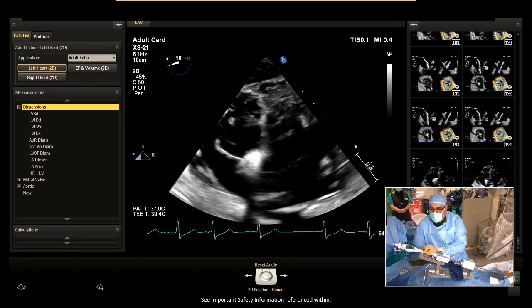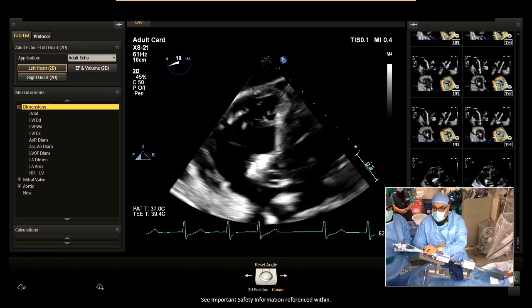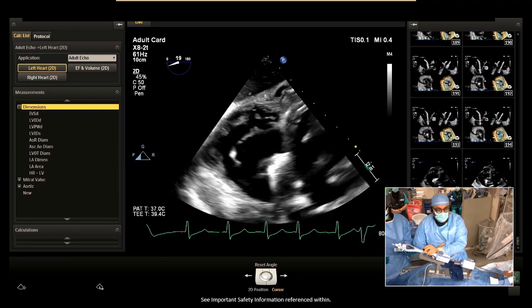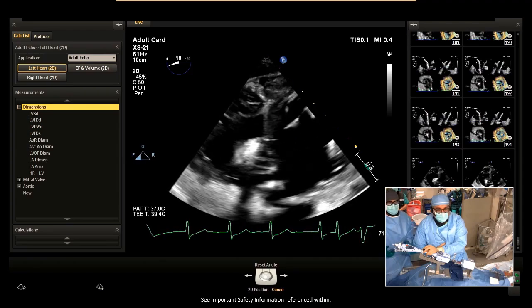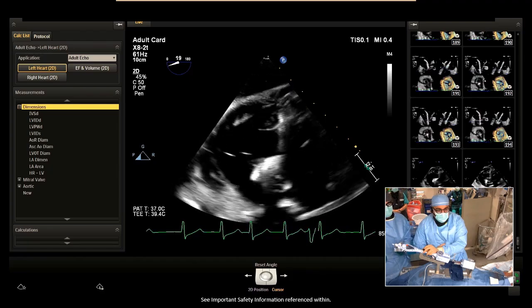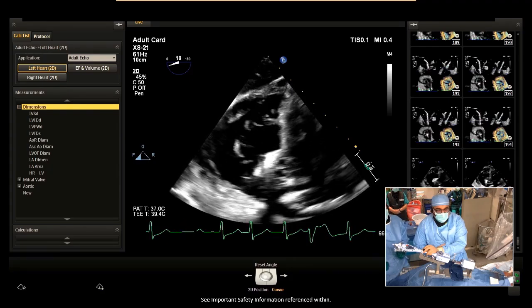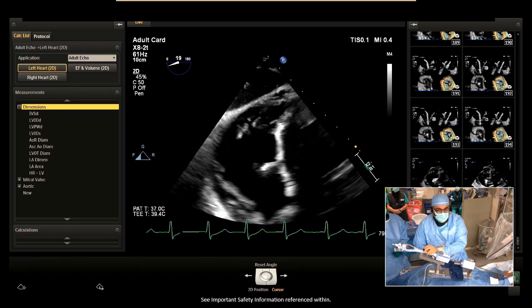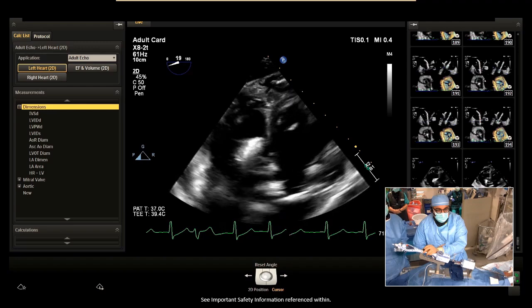And do you think I have to clock this a little bit more, or do you like the alignment right now? I think you're okay with your alignment, actually. Okay. Let me make a little adjustment if that's okay. Sure. What I just can't see is septal. Septal, and I agree with you. I can't see septal either. And sometimes that's the case depending on how you've come in. You get shadowing over the septal leaflet. Yeah. Okay. Oh, we've lost everything there.